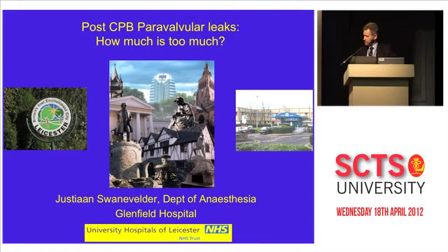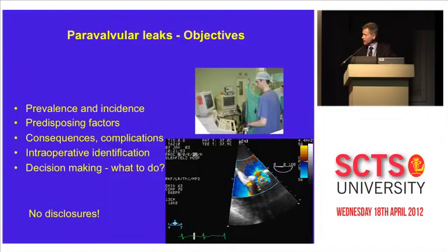Now, paravalvular leaks, and what our objectives are this afternoon, the next half an hour, is to just look a little bit at how often does it occur. We know sometimes the surgeons ask difficult questions. They say, well, what is that little flash you see there? And then you have to think on your feet and make a quick decision on whether they should go back and repair that paravalvular leak or whether we can leave it safely and have no complications afterwards. So we're going to look at that.